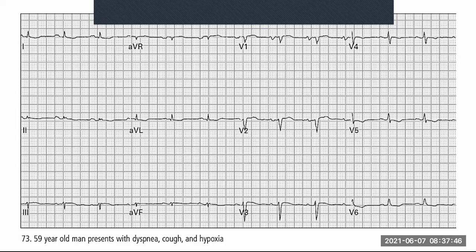Directly around the heart, you could have fluid. Around the lungs, you could have fluid or disease. Around the body, you could have fluid, fat, what else? Clothing, incorrect placement. There's a lot of things that could. What if you put them all on the bones? All your leads are sitting on bones that can't conduct electricity well. So this is what you've got to think of.